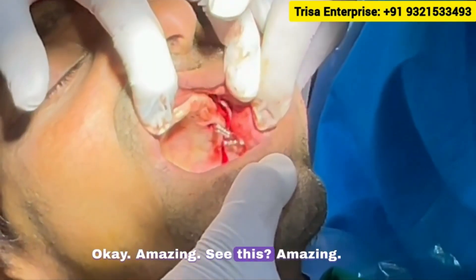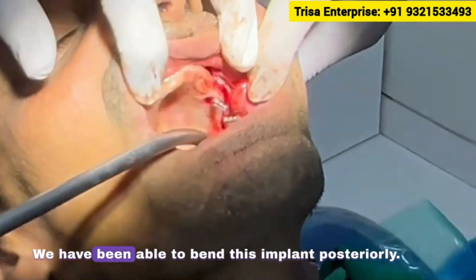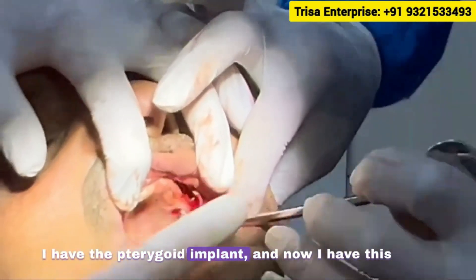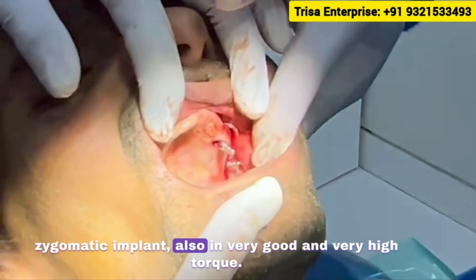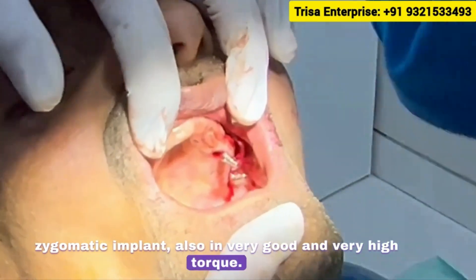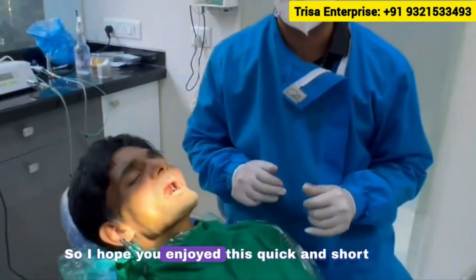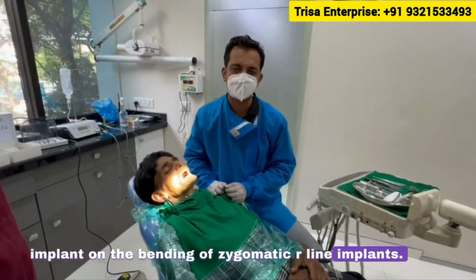Amazing — we have been able to bend this implant very nicely. Posteriorly I have the pterygoid implant, and now this zygomatic implant is also in with very good and very high torque. I hope you enjoyed this quick and short demonstration on the bending of zygomatic R-line implants. Till next time, thank you.